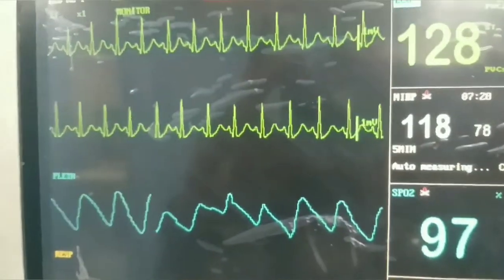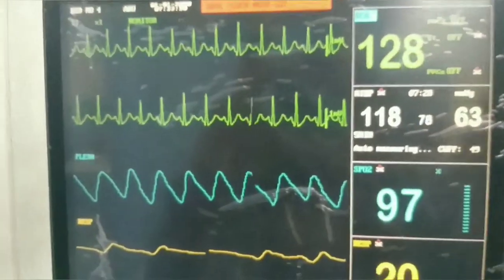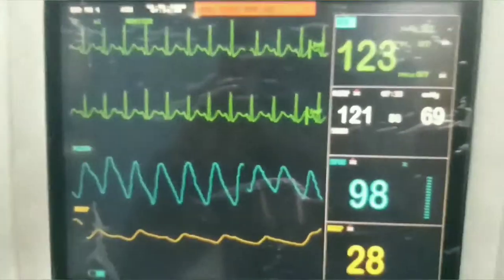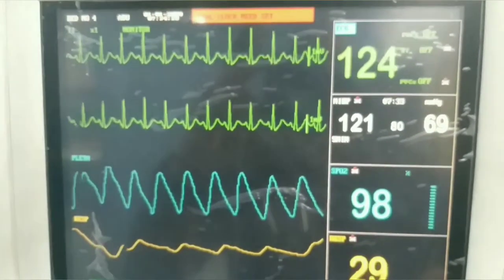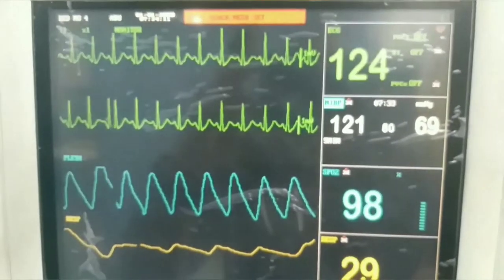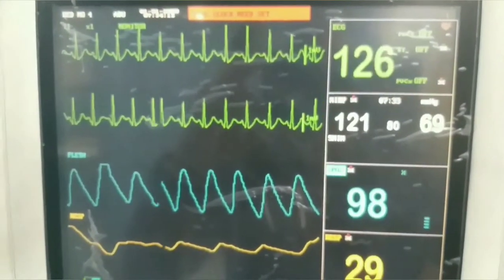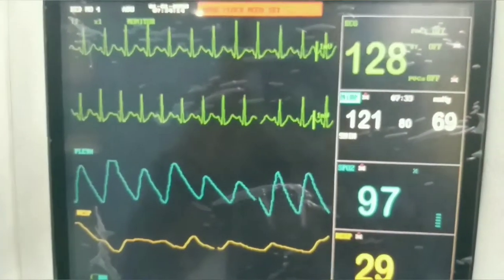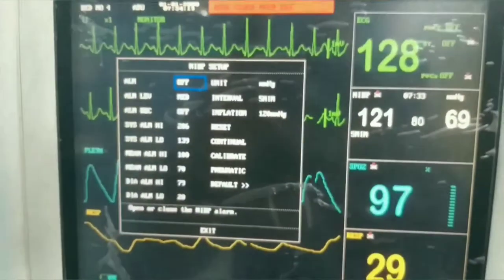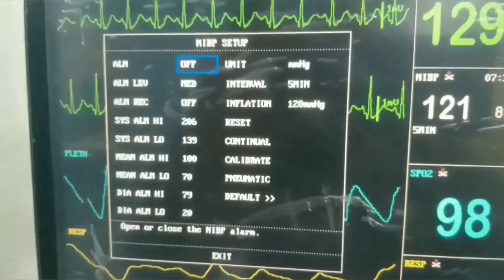The systolic blood pressure is 118, diastolic is 63, and mean is 78 — which is two-thirds of diastolic plus one-third of systolic. It is continuously checked after every five minutes because we have selected the dial at five minutes.